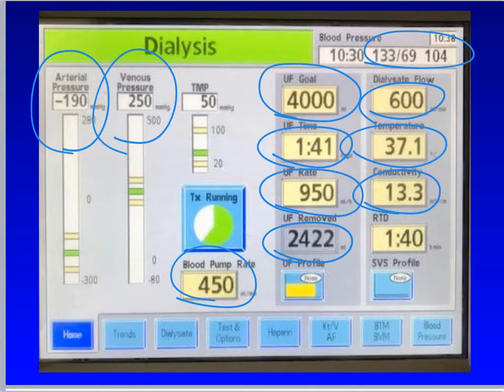Note that with both dialysis and CVVH, when a dual lumen dialysis catheter is used for access, the exiting and entering blood lines are actually both venous blood. They are labeled arterial and venous only so that we can keep track of which one is leaving the patient and which is entering.